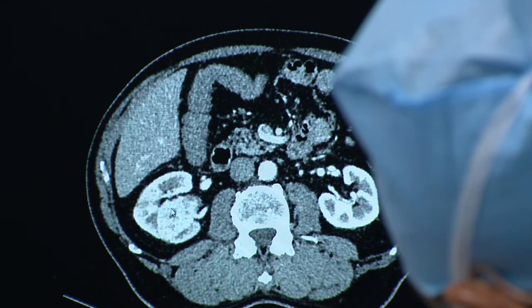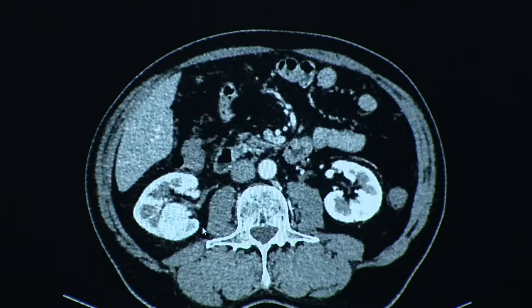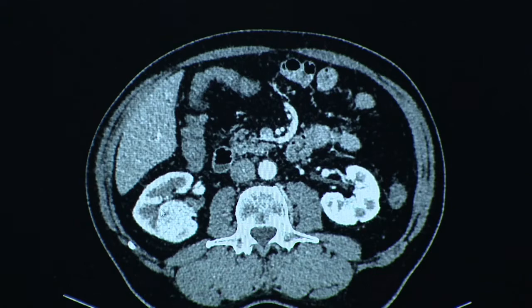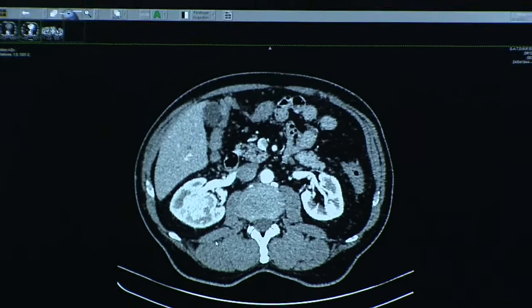And this one is totally going straight into the tumor. So clearly, this is about a 4.5 centimeter tumor that is replacing the central part of the kidney. With this kind of tumor, we would typically tell the patient there's a 50, 60% chance that this will be a radical nephrectomy. His opposite kidney is fine, opposite adrenal is fine. Obviously, it's a challenging case, but I was just wondering, what are your comments?